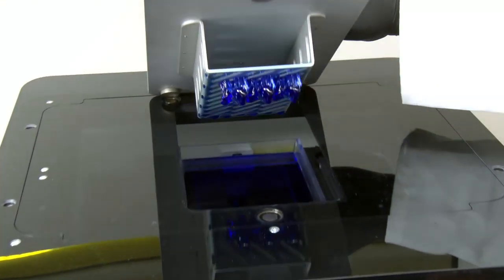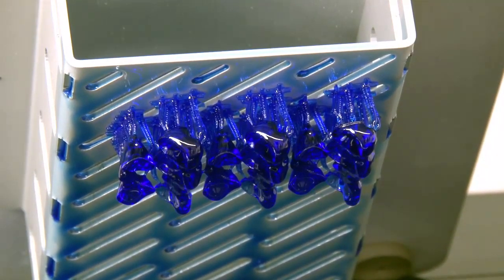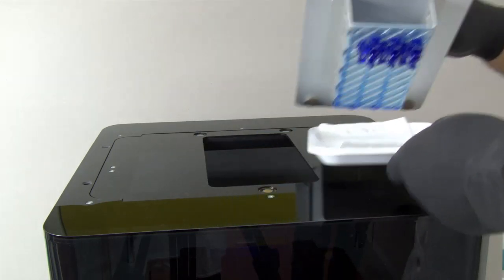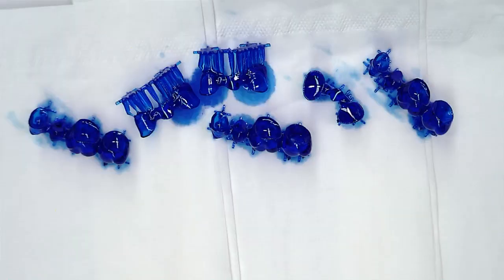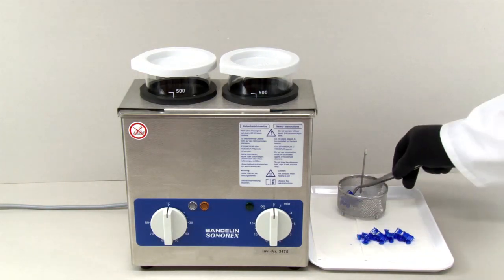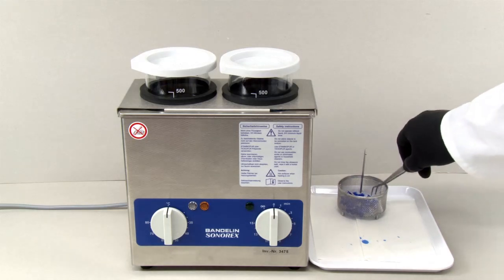Here you can see the freshly printed frames that are still dripping wet. Now a 15-minute wait is necessary to allow the excess resin to drip off. The restorations are removed from the building platform here, which is easy due to the good green strength. The restorations are now placed in a case for the isopropanol bath with the crown openings facing downwards, so that the rinsed resin can drain off and does not collect in the crowns.